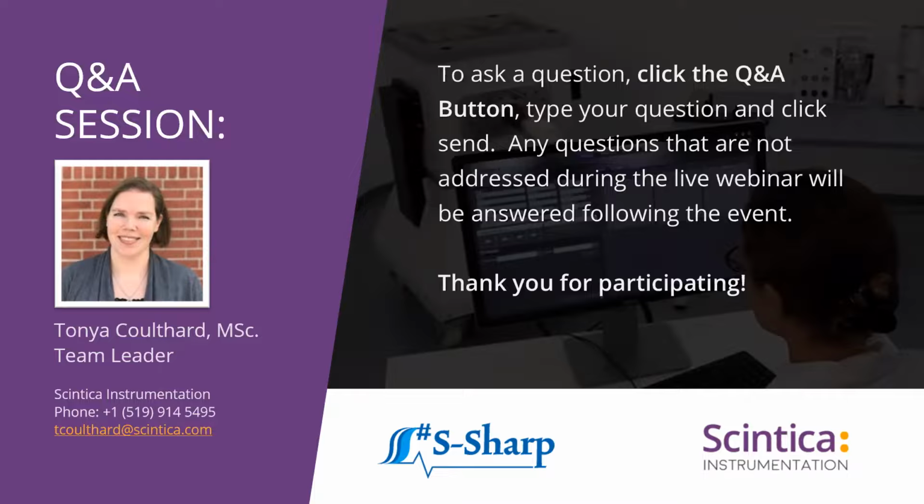Sure. So for those who are more advanced in terms of the physics use, and I see a question around detecting fatty liver disease from Michelle Hempkins, typically at that point, you're looking at very detailed information about the exact frequencies of sound that are coming back and the brightness and the intensities. So it may be that you need to look deeper into the data, and so the system comes with the raw data export capabilities for you to be able to do that, which would probably be the most appropriate way for you to look specifically for fatty liver disease, because that signal is going to come back much brighter, as fat does reflect the sound much more strongly than the liver parenchyma.